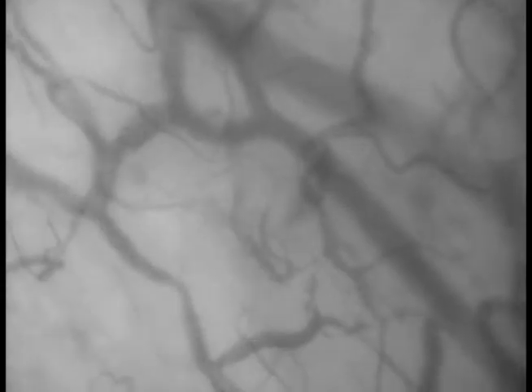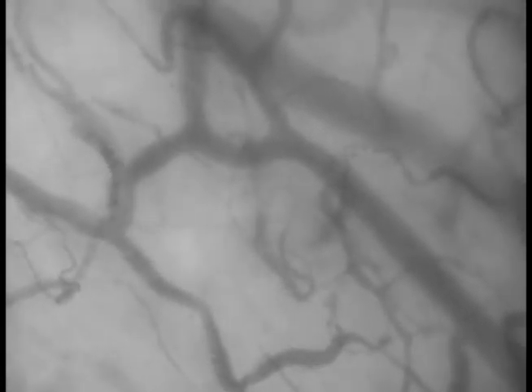A video will get a score of 1 if it shows some signs of questionable pressure. In these videos, it is often not possible to definitively judge if the flow is sluggish due to pressure. Here's our first example. On the left, there is a junction of vessels with various types of flow. This could be pressure, but since flow all around the vessel is continuous, we cannot say that the slow flow we see in the junction is definitely caused by pressure.